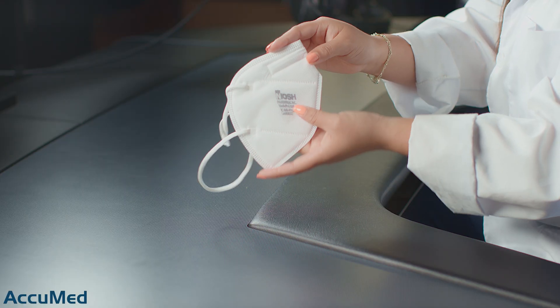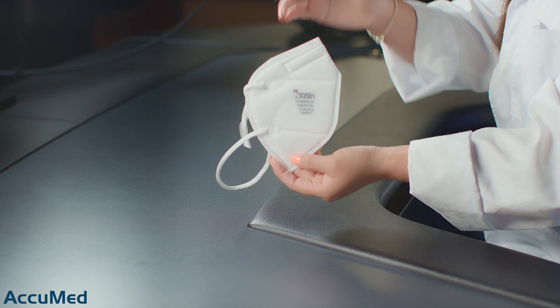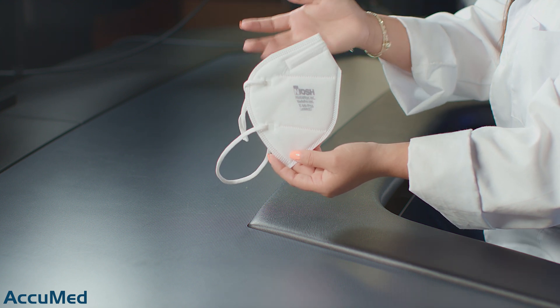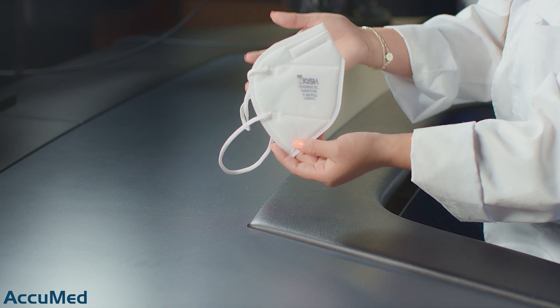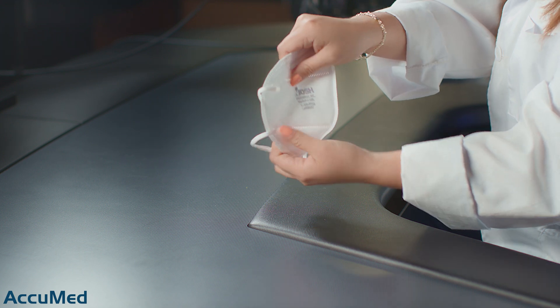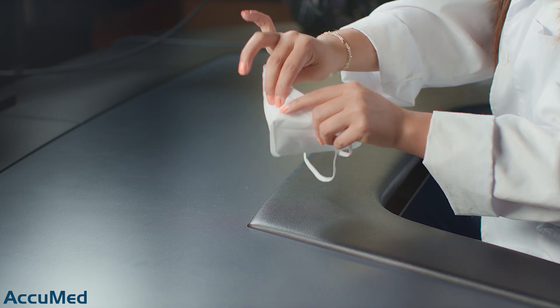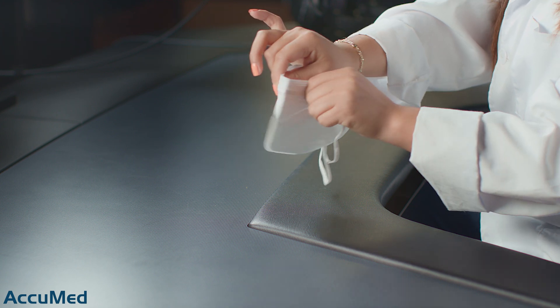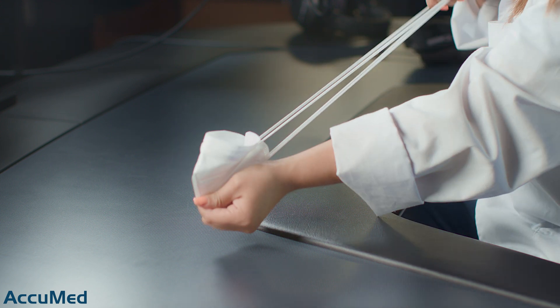The first thing I'd like to say about this respirator is that you can't really read the markings on it. Per NIOSH requirements, the manufacturer must add this information to the respirator, but it is very hard to read what it says. It is a very thin material considering it is a five-layer mask. It does have a very flimsy nose wire.